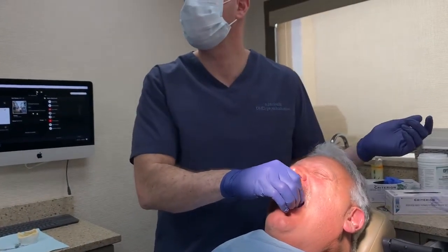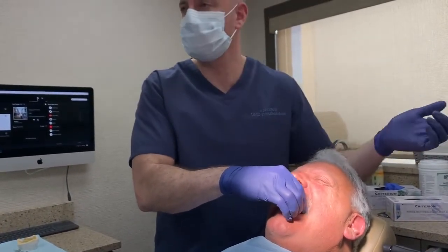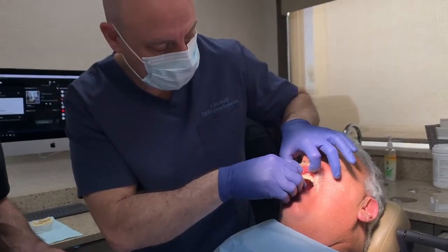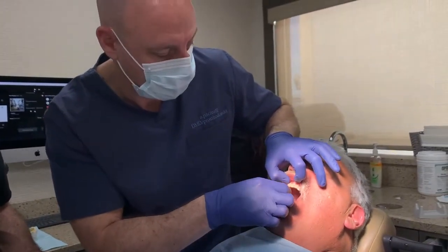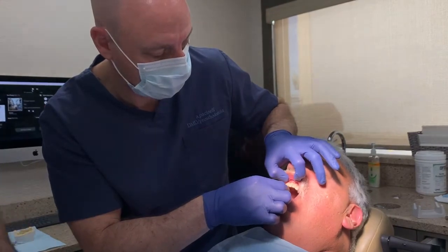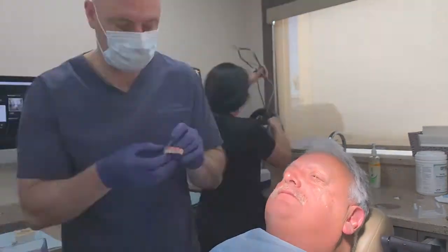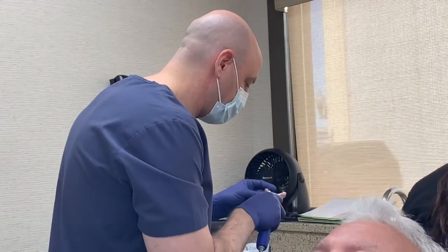If you've screwed in all five screws, then I have to unscrew all five screws. It's annoying. You see? I got it. You see it? It's unblanched. So the second he took it off, the color came back. You know what I'm saying?